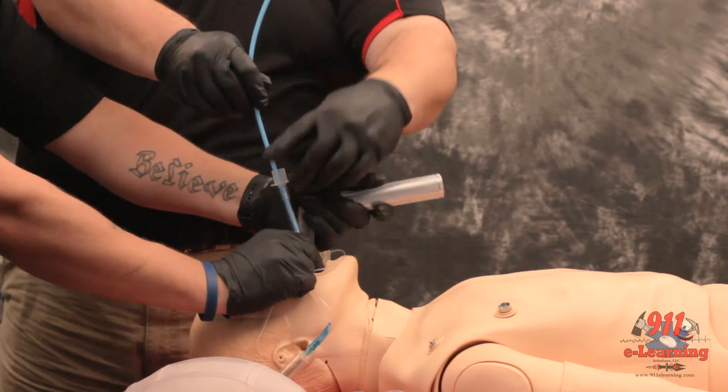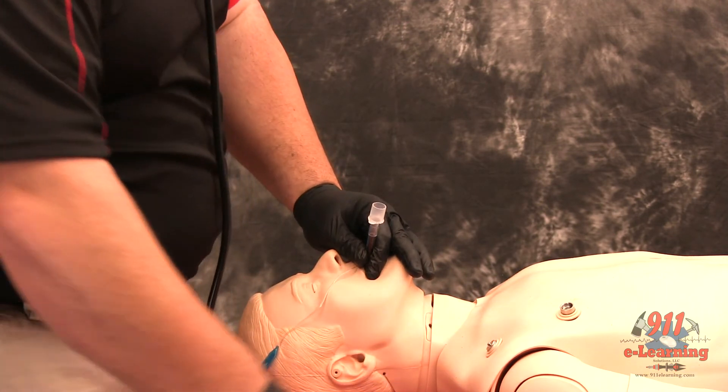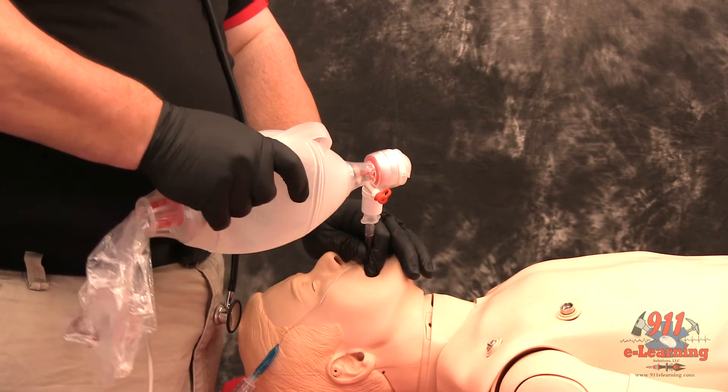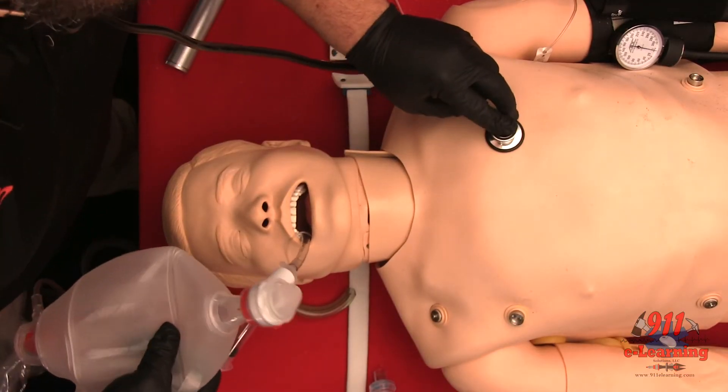Once the ETT is correctly placed, hold the ET tube securely and remove the bougie. Confirm tracheal placement according to the intubation protocol. Auscultate for breath sounds and reposition accordingly.